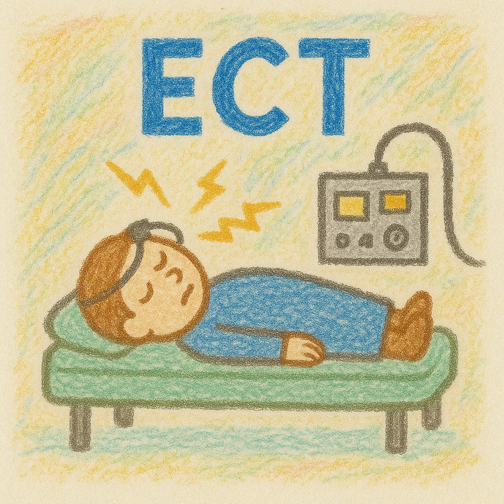There's also another placement called LART, which is an acronym, which stands for left anterior right temporal. So you put one stimulus electrode 5 centimeters above the outer canthus of the left eye, and the other stimulus electrode on the right temple area. And that is also designed to be a bilateral memory sparing placement. You're trying to avoid those hippocampal structures while still being a bilateral treatment hitting both hemispheres of the brain.